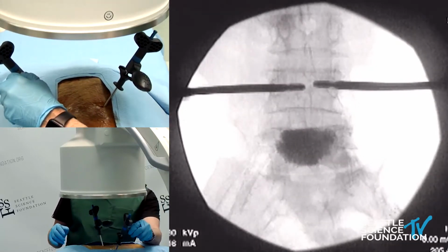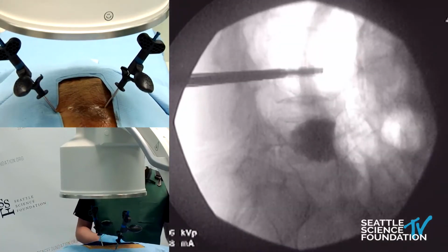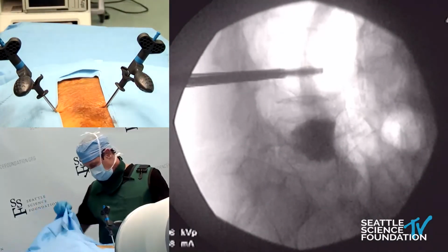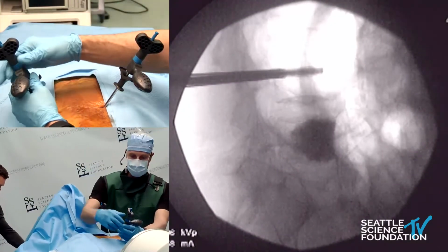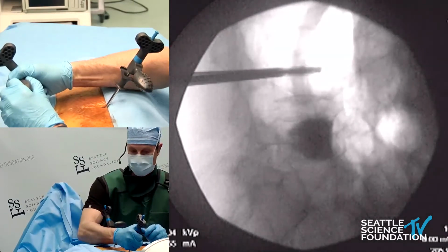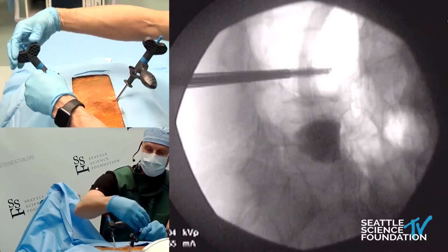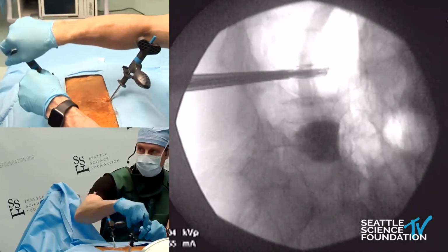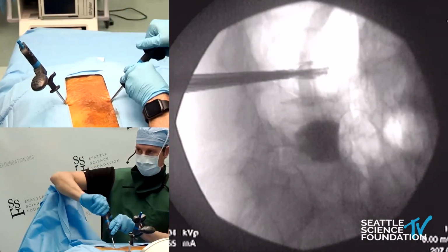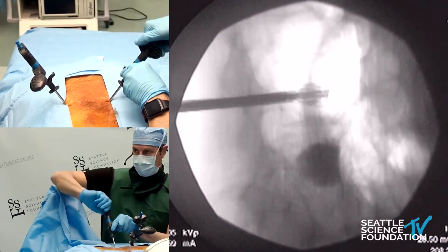All right, and we'll save that, and then let us go back lateral and we'll deploy, final position. And we're mixing the Striker HV cement in back. It's the one with the automated mixer that really is loud and disrupts our audio, so we're doing it in back. All right, so I'm going to deploy clockwise, and we can see the spine jack come up. And 2, 3, 4 turns there, same thing here. I'll give it live so we can watch the jack come up. There it goes.